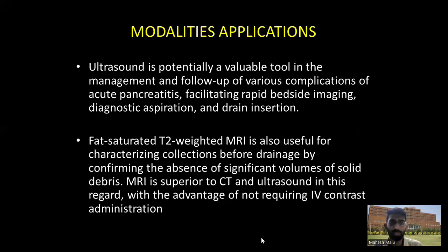Other modalities and their role. Ultrasound is potentially a valuable tool in the management and follow-up of the various complications of pancreatitis, facilitating bedside imaging, diagnostic aspiration, and drainage insertion. While fat-saturated T2 imaging is useful for characterizing the collection before drainage.